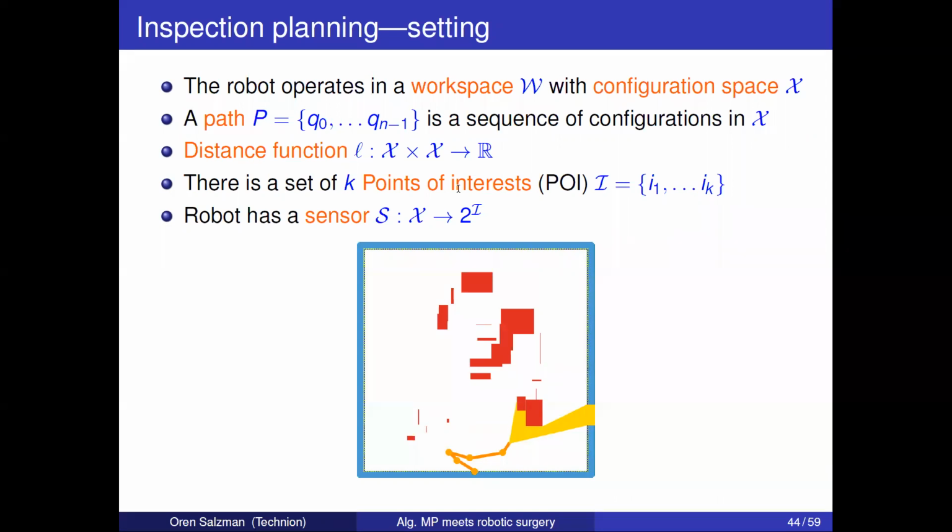Right now, we're looking, for example, for steerable needles, at what is the right point to puncture. This is why it's very much related to your question. Where do we want to enter the body to be as robust as possible to uncertainty? And that's even before looking at the fact that the human body is not homogeneous, and how do we give a good model of the system. And these systems are really hard to model.